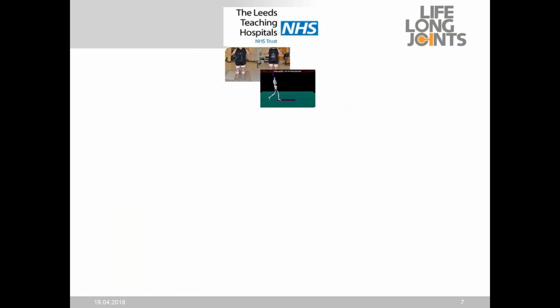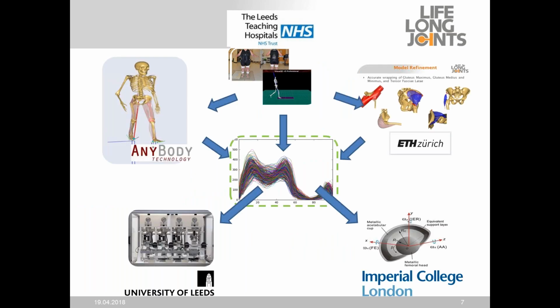Within work package 3, as you heard from Richard, this is where we sat. We collected our data, we passed the data and worked collaboratively with Morten Kasper from AnyBody Technology to generate a large number of joint contact forces for all the activities that were collected, which I'll go on to. We also work closely with Professor Stephen Ferguson and Enrico De Pieri at ETH Zurich, who did a lot of the work in refining the AnyBody model and trying to make it valid and as reliable as possible through comparing it to the OrthoLoad database.